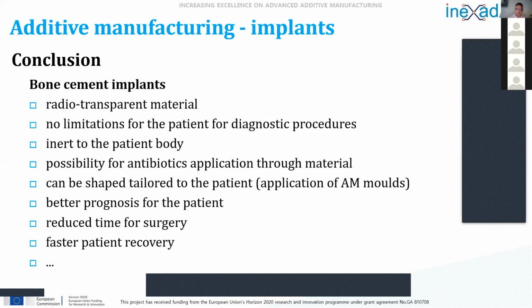As I already told you, when you apply bone cements, you have the possibility to apply antibiotics to the patient through the material. As I know, this is the only material that allows such a treatment of the patient, but maybe I'm wrong, though according to my knowledge, it's the only one.